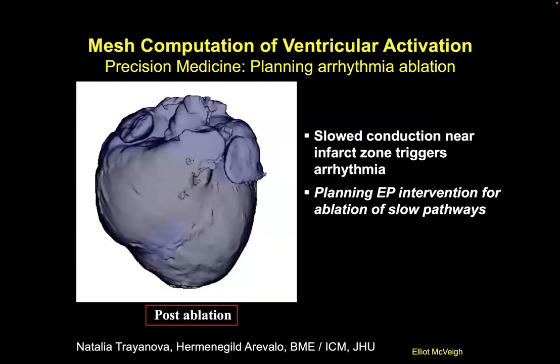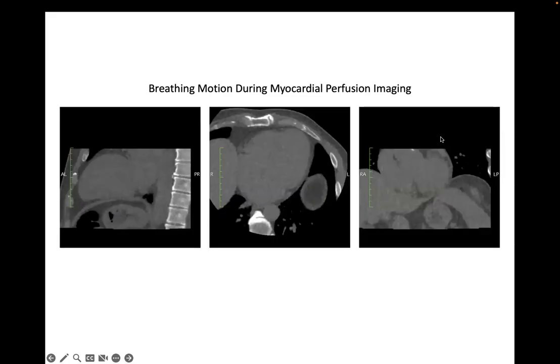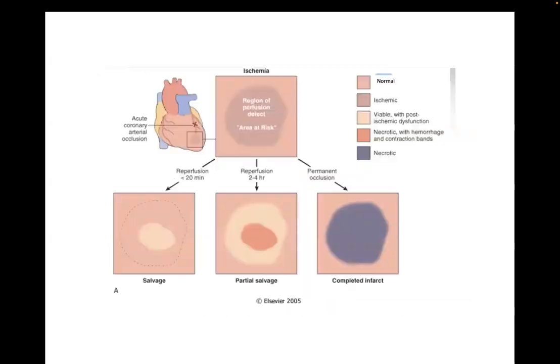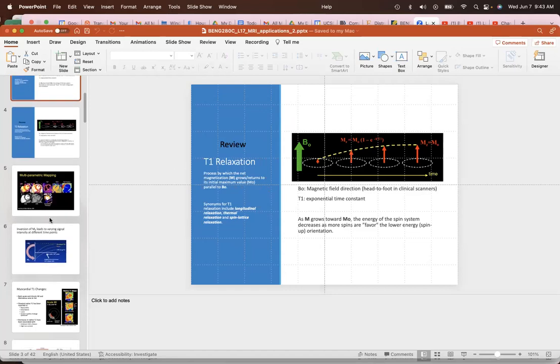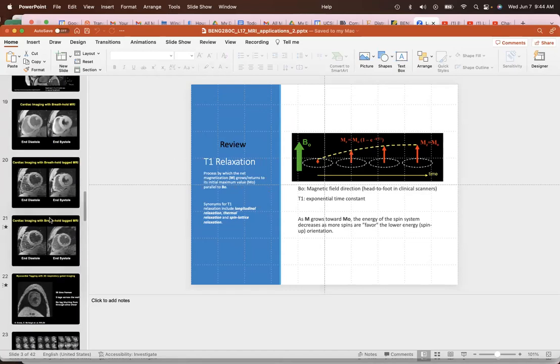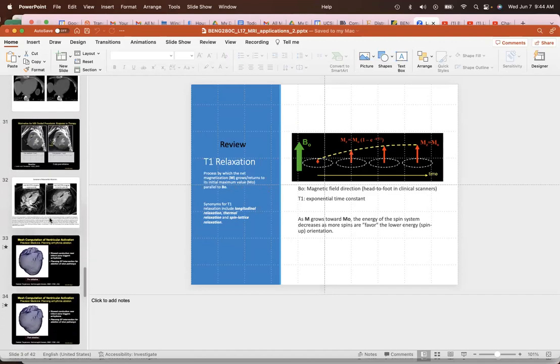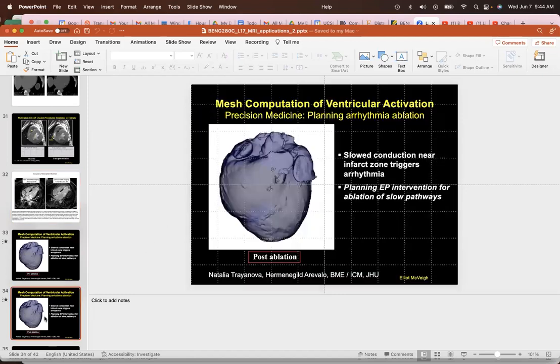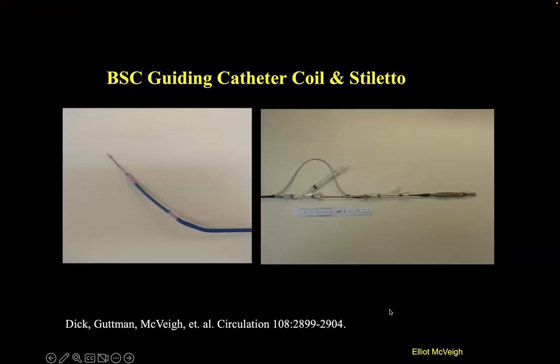And that's one of the reasons why we went to try and produce images not like this, but remember the images that were crazy high resolution. These, I think they're back here. Oh, maybe they're not. Sorry. The super high resolution images of an infarct is what we were trying to produce, and we just couldn't do it, because the tissue just didn't come back to the same place from beat to beat. So we gave up. So one day somebody will figure out how to do it.